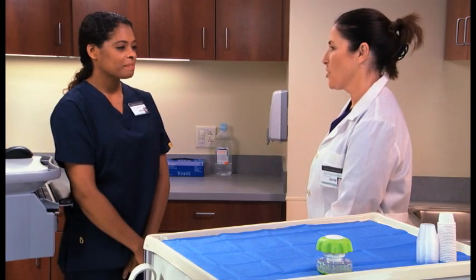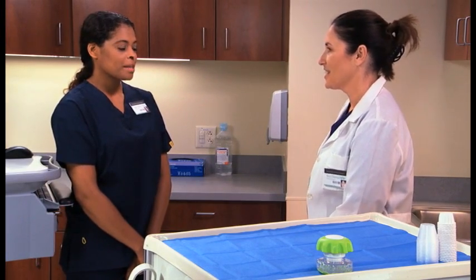So what can you tell me about your patient, Talia? He had oral surgery for tongue cancer, so he has a gastrostomy tube for supplemental feeding to help him consume sufficient nutrition. Right. It's also very difficult for him to swallow his medication because of mouth ulcerations related to chemotherapy. So we're using the gastrostomy tube for medications as well. Then you'll use liquid medications whenever possible.